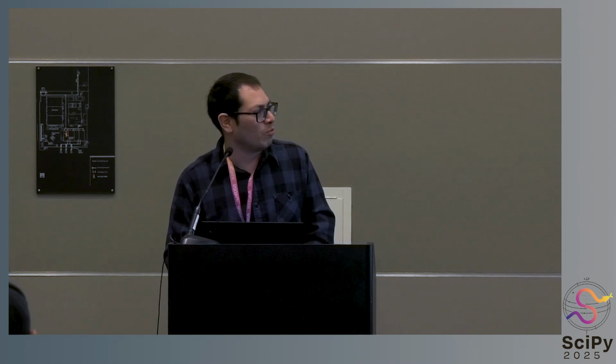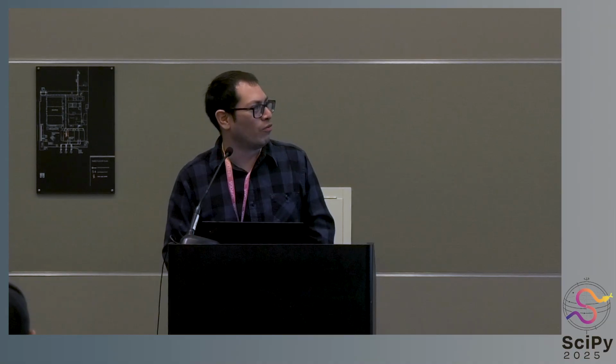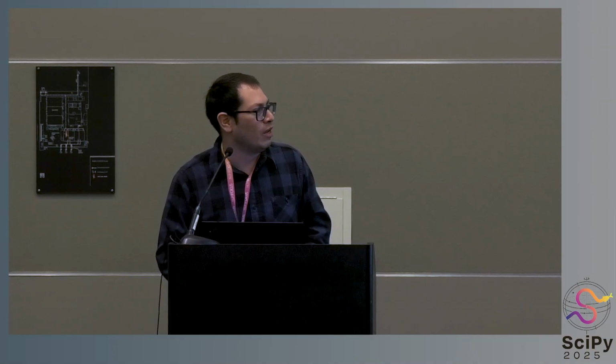So instead of being this huge 30,000 by 40,000 pixels, it is just 700 by 700 pixels. So it is a downsampled version of the image. And we can compute on that rather easily compared with the full image. So we can operate on this downsampled version. This process is described in the solutions. It's basically the idea of creating a mask from that low resolution and then extrapolating that into our full resolution image.